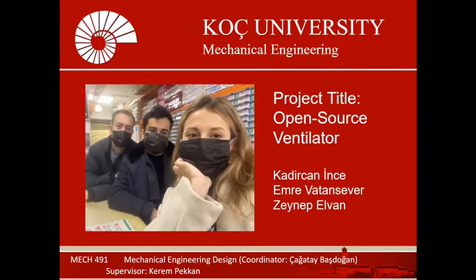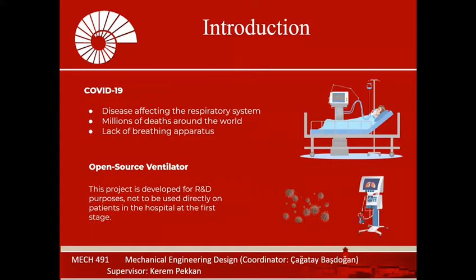Hello everyone. Today we would like to present to you our final project, an open source ventilator, with my teammates Zeynep and Kadircan. A ventilator is a machine that provides mechanical ventilation by moving breathable air into and out of the lungs to deliver breath to a patient who is physically unable to breathe or breathing insufficiently.